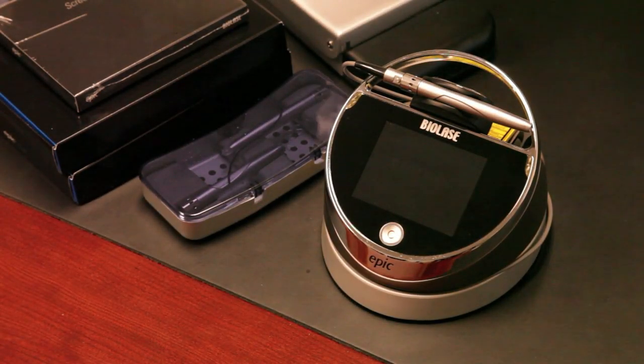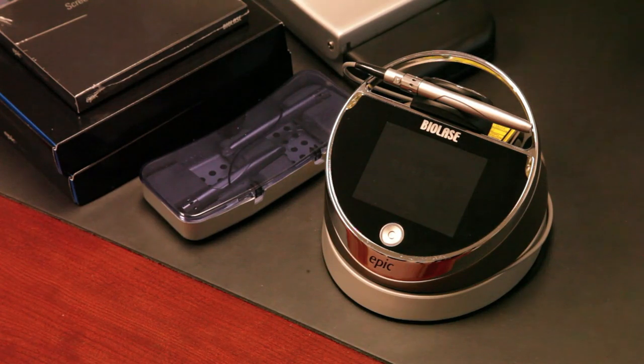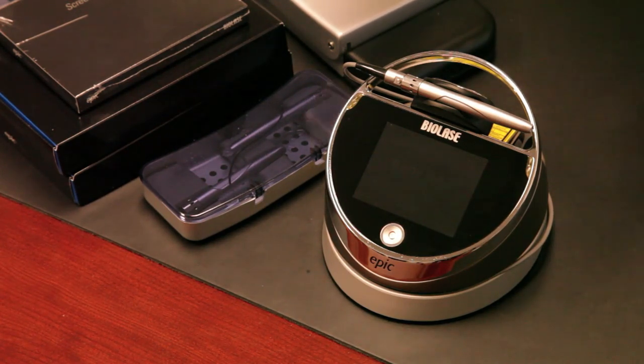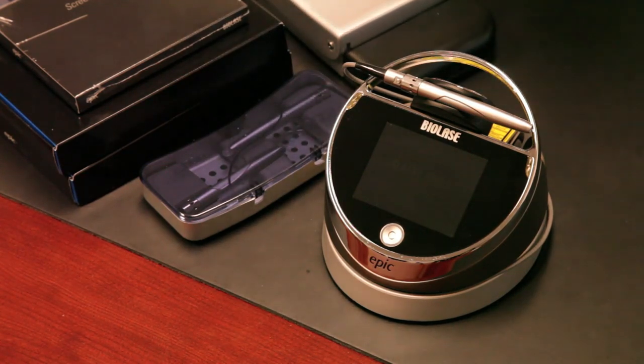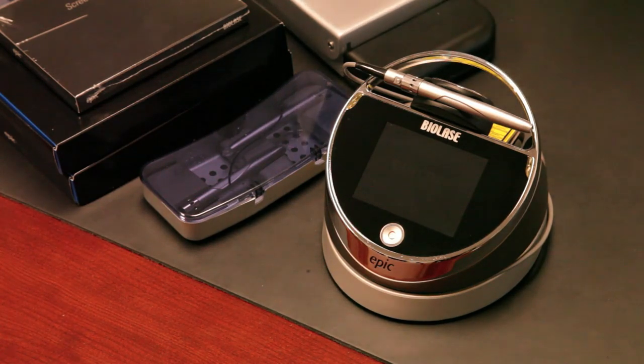We're here today to walk you through the essential components of our EPIC Total Diode Solution, the newest laser from Biolase. The intention of this quick video is to show you in a few minutes what the laser looks like, how it feels in your hands, and some of the basic components that come with our basic EPIC package, as well as the whitening package and our Total Diode Solution package, which includes a pain therapy handpiece.